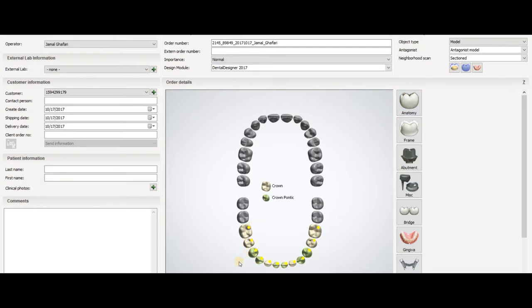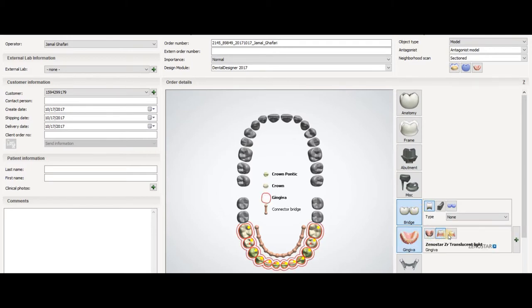You have to select the other one for the adjacent teeth, then select the bridge. Also select the gingival option — if you are going to do a cut-back for the gingival you can select this one; for full contour you can select the gingival option.